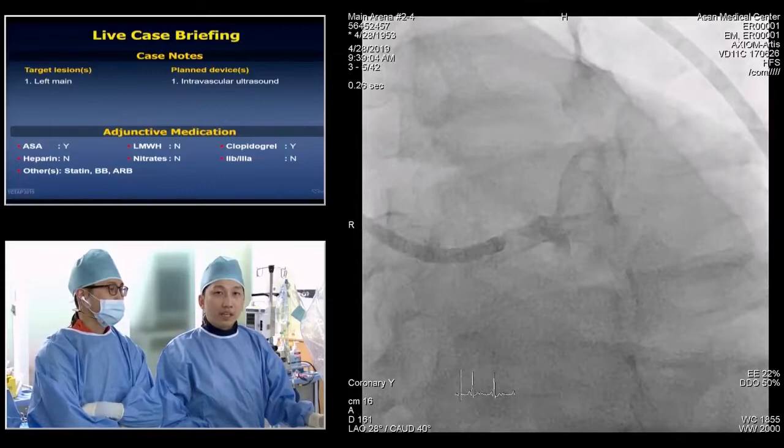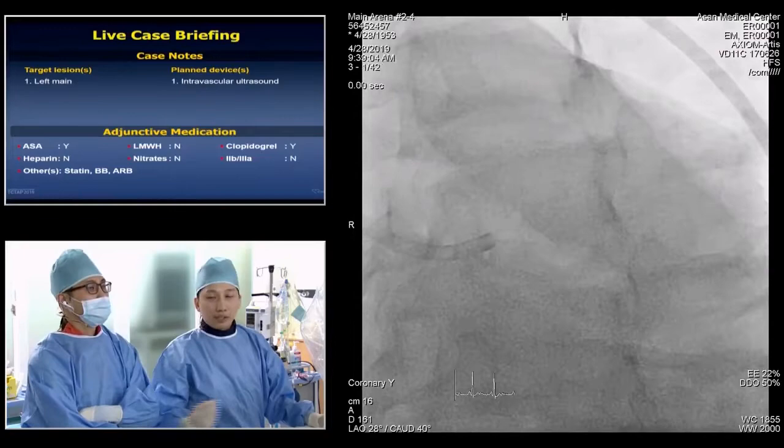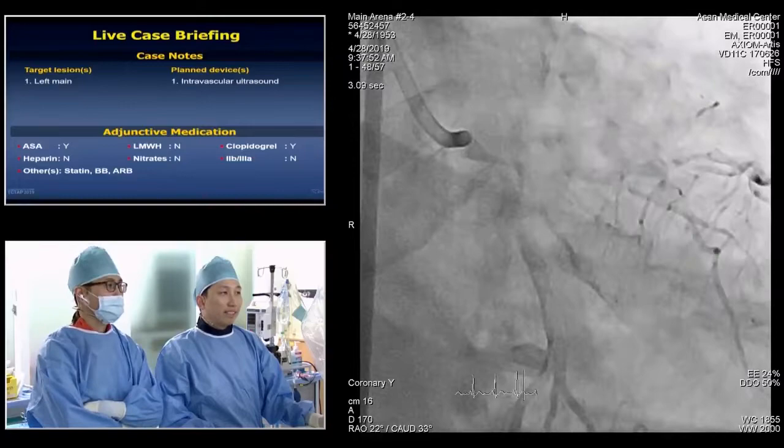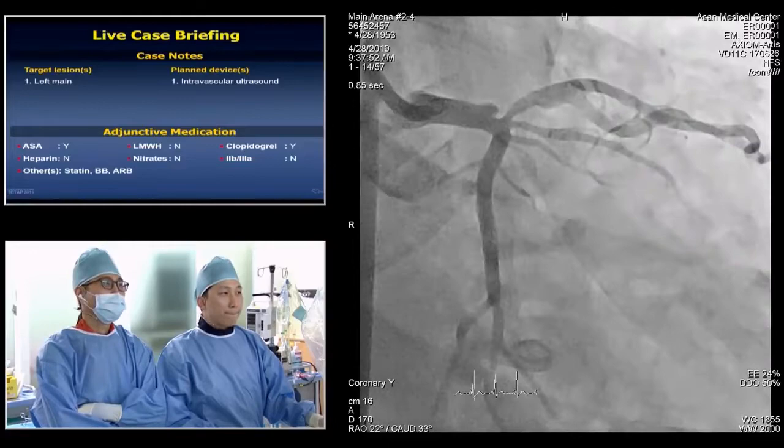So I'll ask Gary. Gary, what is IVUS going to show? Is it going to show a ruptured ulcerated plaque, or a big calcific nodule? What do you think? It's an unusual angiogram. What do you think this will show? My first guess would be a ruptured plaque in the distal left main. I think that's the most likely finding.